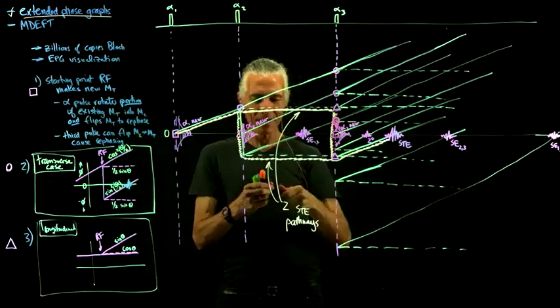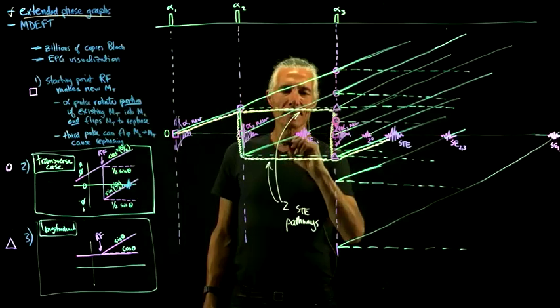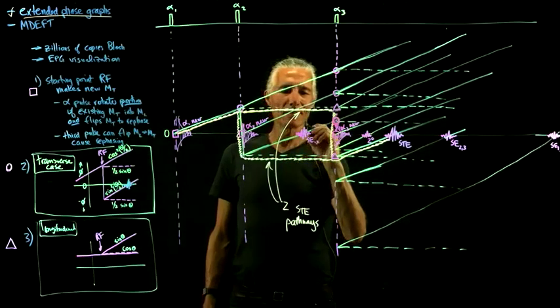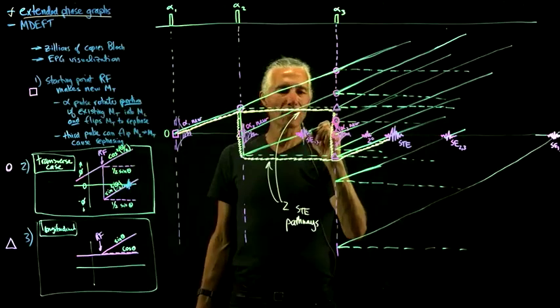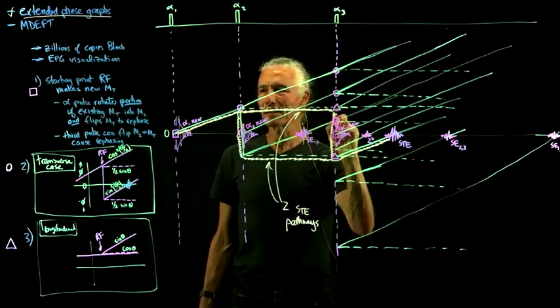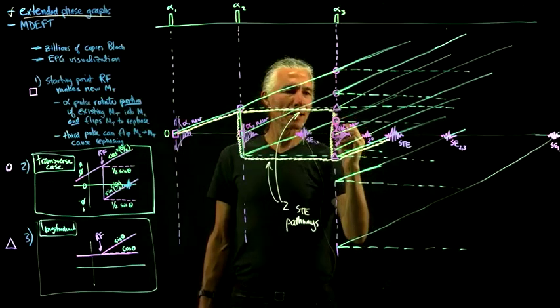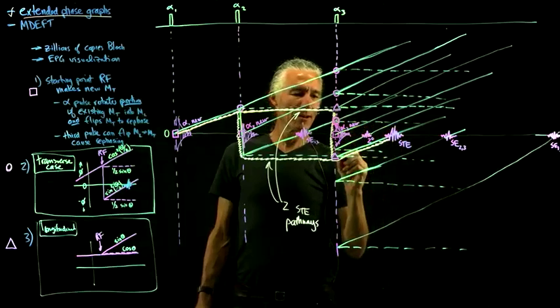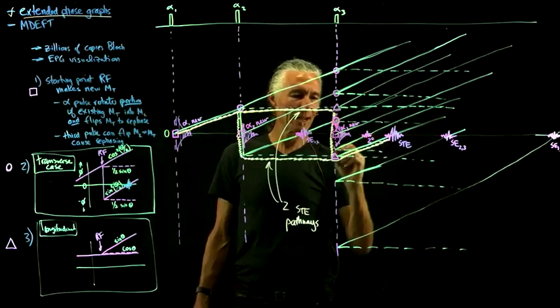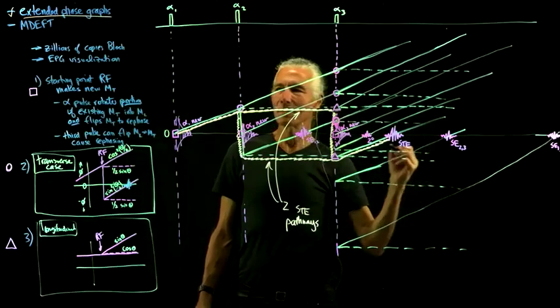Yeah. So what was happening here is that this was the spin echo 1, 2, and this part of spin echo 1, 2 sort of acts as if it was an FID, and so that's some dephasing transverse magnetization that's heading up here, and we hit it with RF pulse 3, and so then it leaves some dephasing, makes some saved longitudinal, flips 180 degrees, makes some dephasing, rephasing down here, which is the one that makes the echo, and puts some 180 degree out of phase saved longitudinal there.